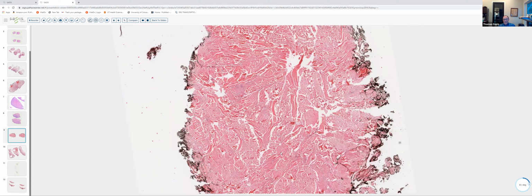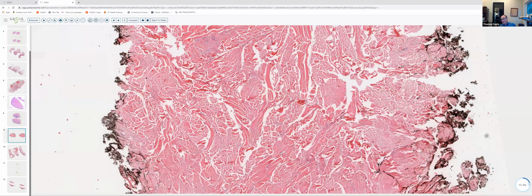Connective tissue nevi can be composed of excess amounts of collagen or thickened collagen bundles. One can see an increased amount of ground substance, or one can see an increased amount of elastic tissue, or any combination of the two. This is a collagenoma. The collagen is actually thickened and characterized by this haphazard arrangement. A lot of times when we see these histologically, if we're thinking about it, we'll get an elastic tissue stain. If the elastic tissue is absent, then that's very suggestive of a collagenoma. But the elastic tissue can be normal or increased in a connective tissue nevus.